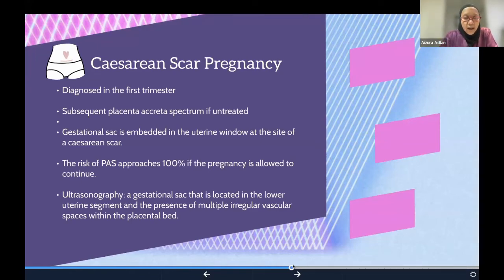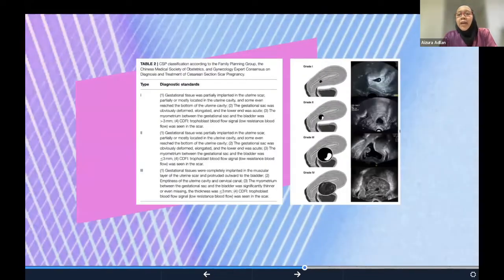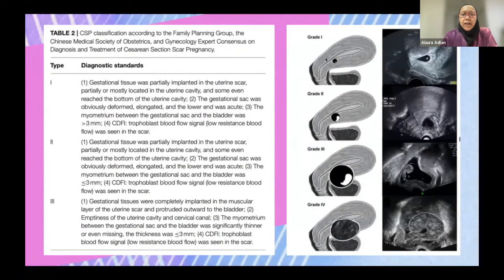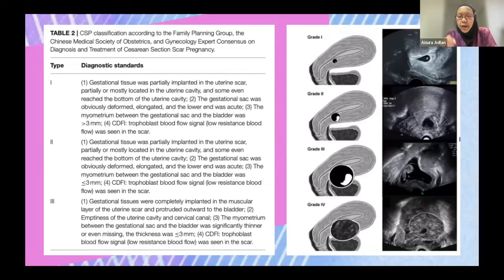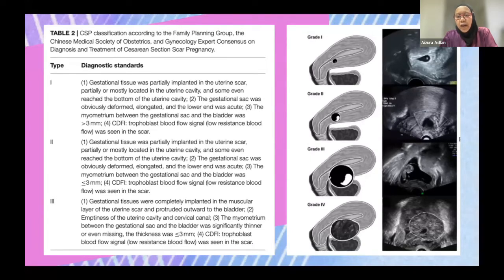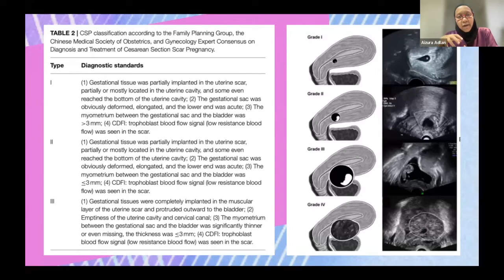On ultrasonography you will see: an empty uterus with a good endometrial lining visible, a gestational sac near the isthmus, and on Doppler — peritrophoblastic vascularization in the area of the isthmus. In more advanced cases you may see thinning of the myometrium and a compromised plane between the myometrium and the bladder. The Chinese Medical Society has categorized cesarean scar pregnancy into three types based on depth and location of implantation.